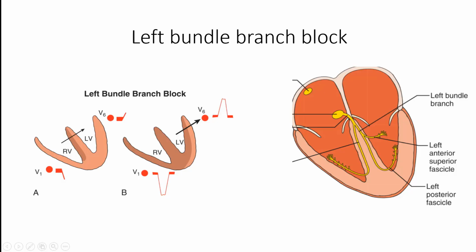In the case of a left bundle branch block, you can see that there is going to be a block in the left side of the intraventricular septum because of the location of the left bundle. Consequently, we are not going to see the left side of the septum participating in manifesting conduction in the form of the septal R wave or septal Q wave. Quite simply, the right ventricle and the left ventricle are going to combine and demonstrate their depolarization without that initial septal depolarization.